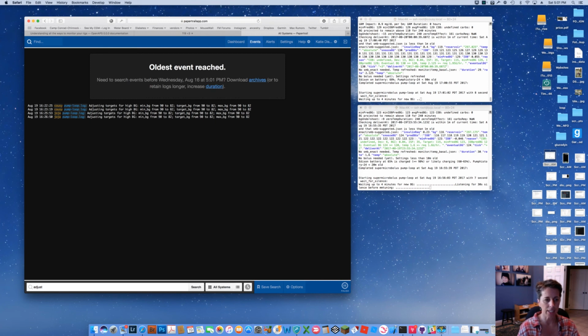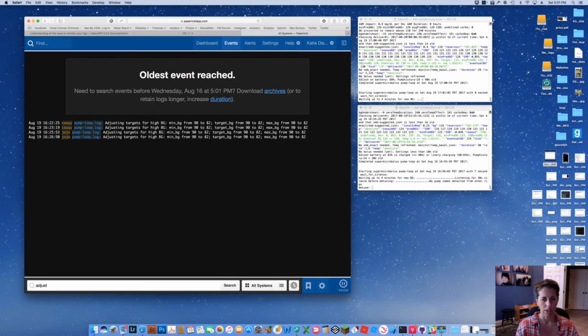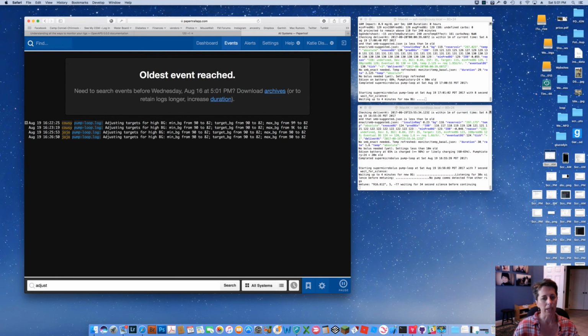If you go to adjust, this actually tells you what your AutoSense is doing for you. It's pretty cool. If you do adjust, you can see what AutoSense is doing. It's adjusting my targets because that's enabled from 90 to 82, and the targets are going from 90, which is what her normal target is, to 82, and max IOB, all of that. You can also see in here if the insulin sensitivity is being adjusted or other things.